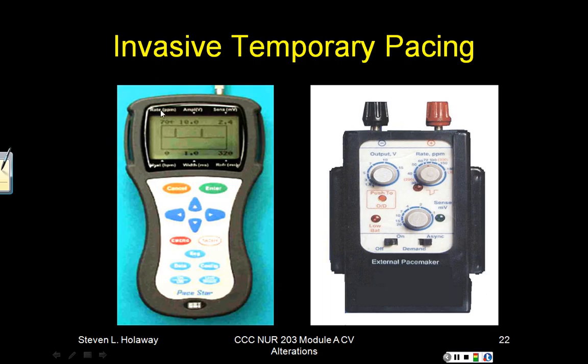The new digital ones are designed for shielded leads, so that you don't have to worry about something called microshock. With the old ones, you had to have a bare metal tip on the pacemaker wire or lead that's going into the heart. You could actually cause a patient to go into ventricular fibrillation through microshock.